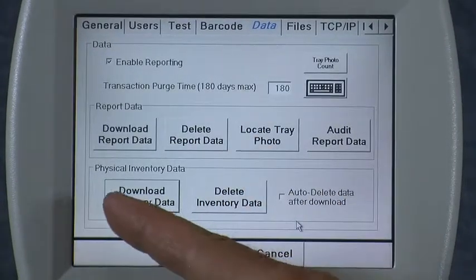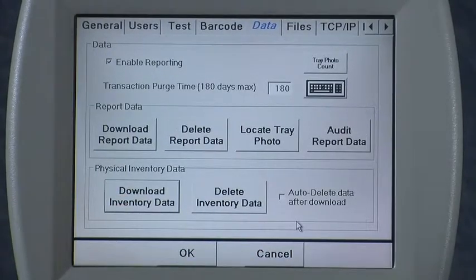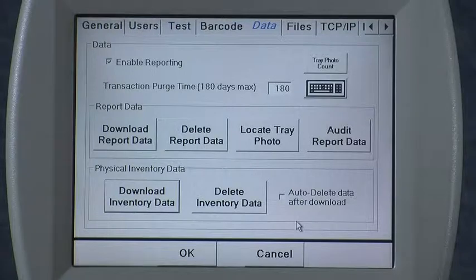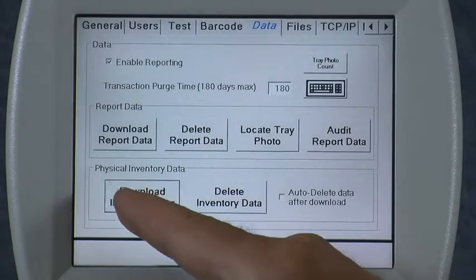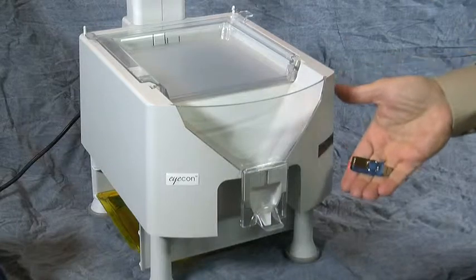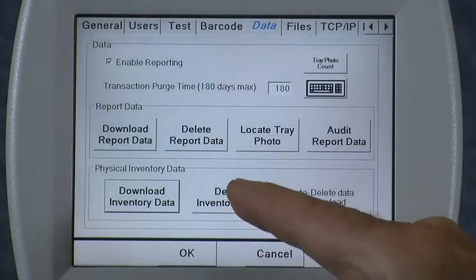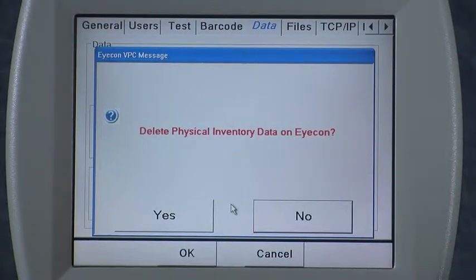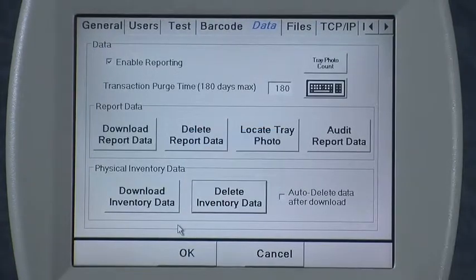The last section on the data tab is the physical inventory data section. The first button, download inventory data, is used to download all of the data you've collected while counting the inventory in your pharmacy, putting it into a file format that can easily import into various programs on your computer as well as into some of the pharmacy management systems that are out there. Press the download button and it lets you know it's created that file in that format, and it allows you to download the data to a memory stick. The next section is delete inventory data — before beginning a new inventory, you first want to delete any data from prior inventory counts and start fresh. Confirm yes when asked and it goes ahead and deletes that data.